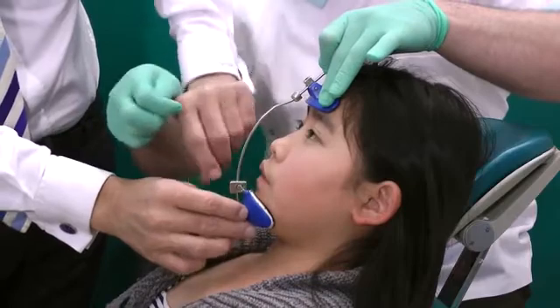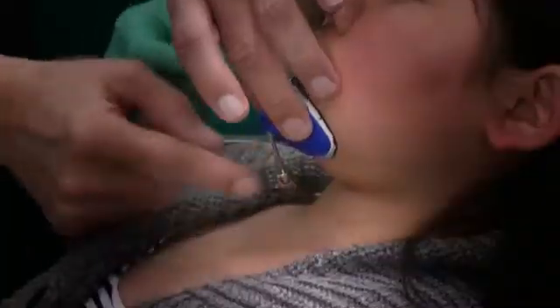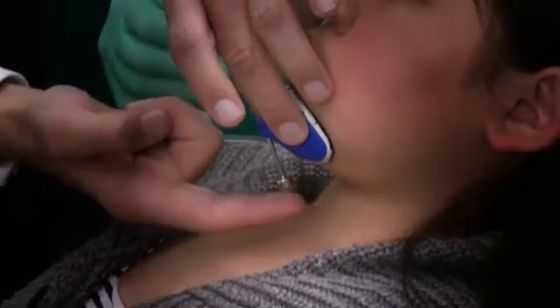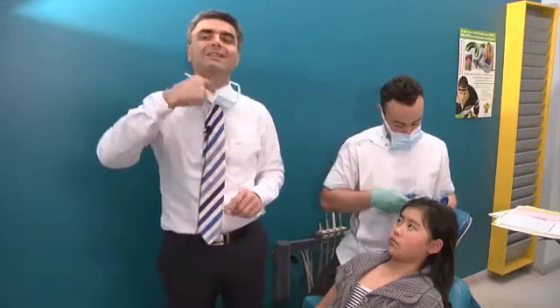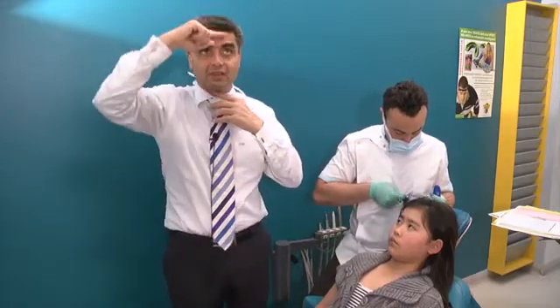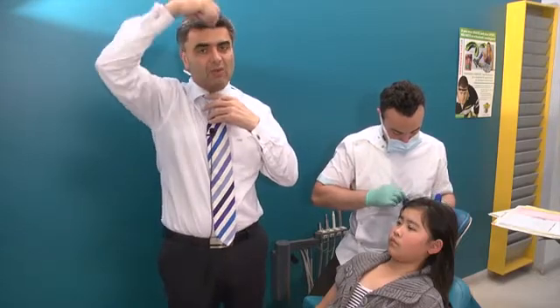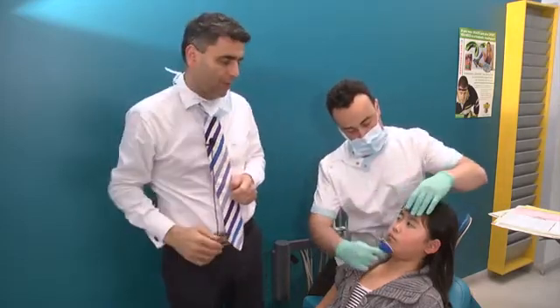One thing I'll just show you here — there's a big risk factor. I've seen some transfer cases where this has been fitted incorrectly, where it's sliding down and sticking out almost ready for a tracheostomy. So what we don't want is anything sticking this way. Once you've customized the mask, any excess should be up here. Then what I normally do is get a high-speed handpiece and cut the excess and put the plastic cap on top to stop the rubbing.